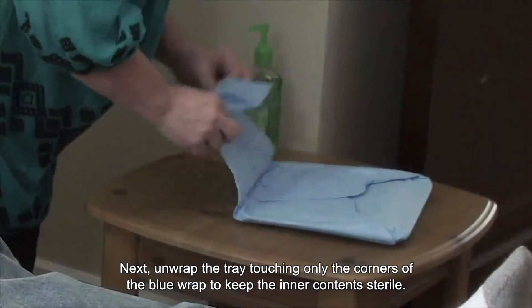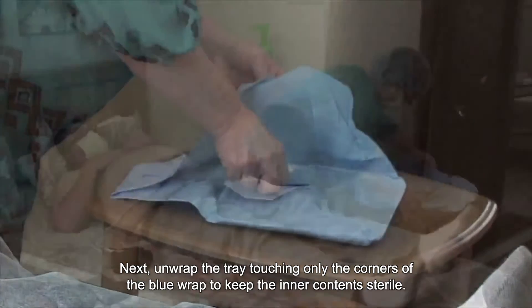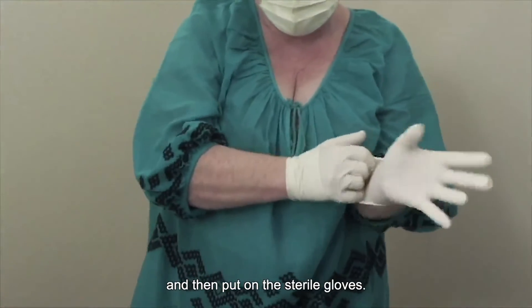Next, unwrap the tray touching only the corners of the blue wrap to keep the inner contents sterile. Wash your hands again or use hand sanitizer and then put on the sterile gloves.